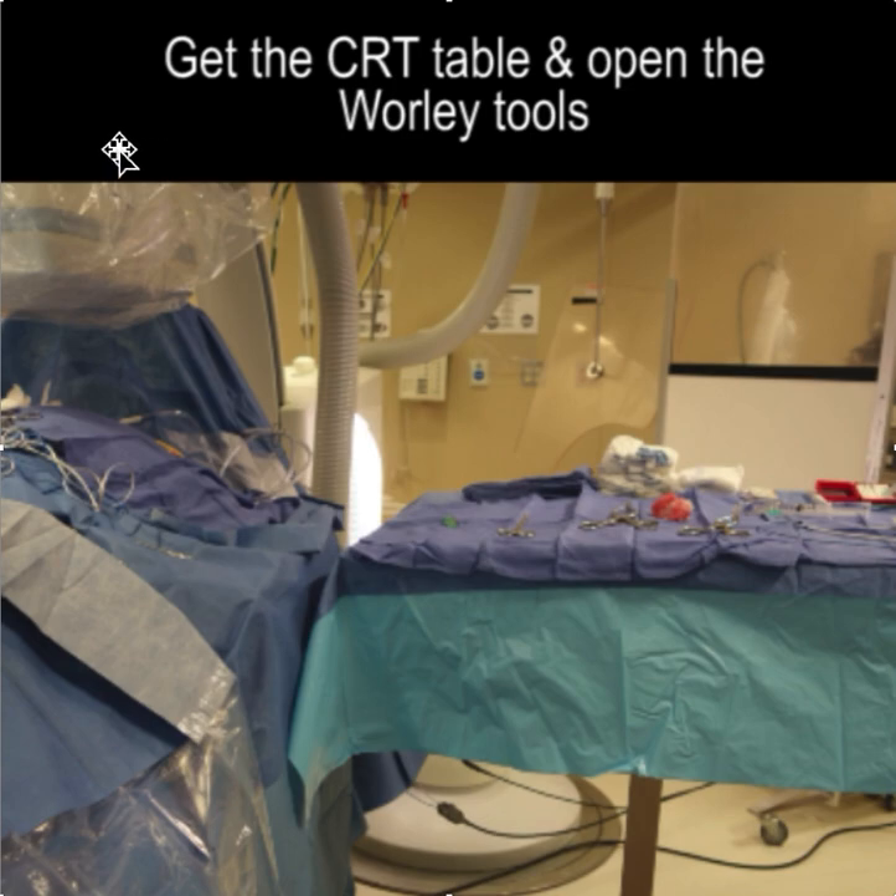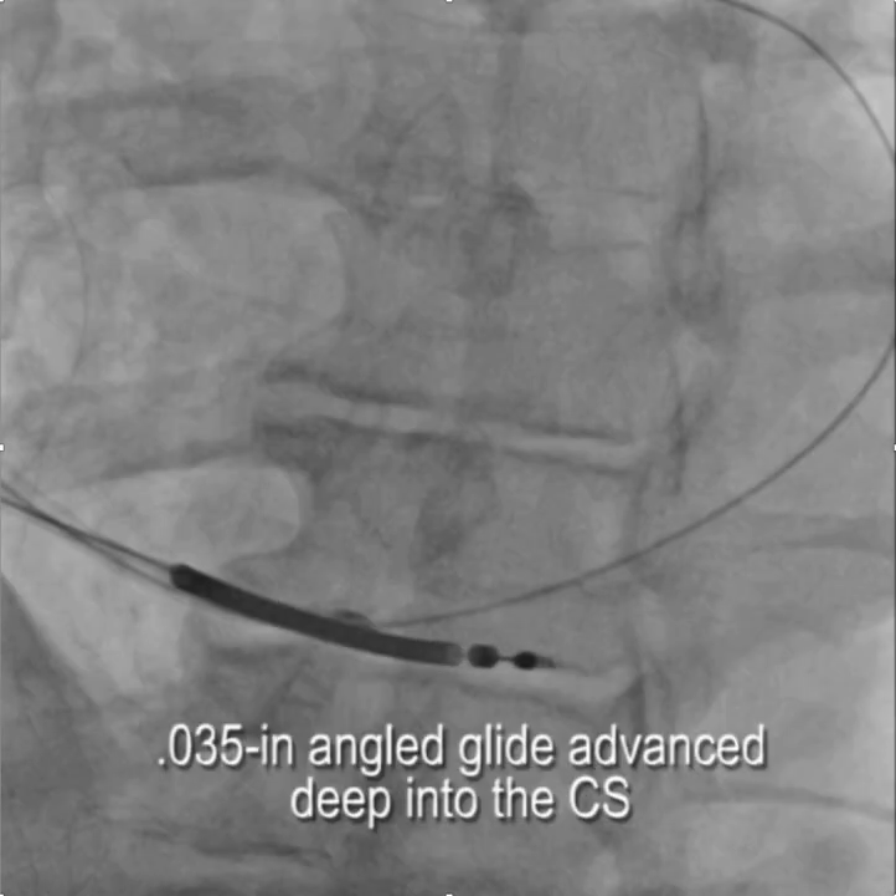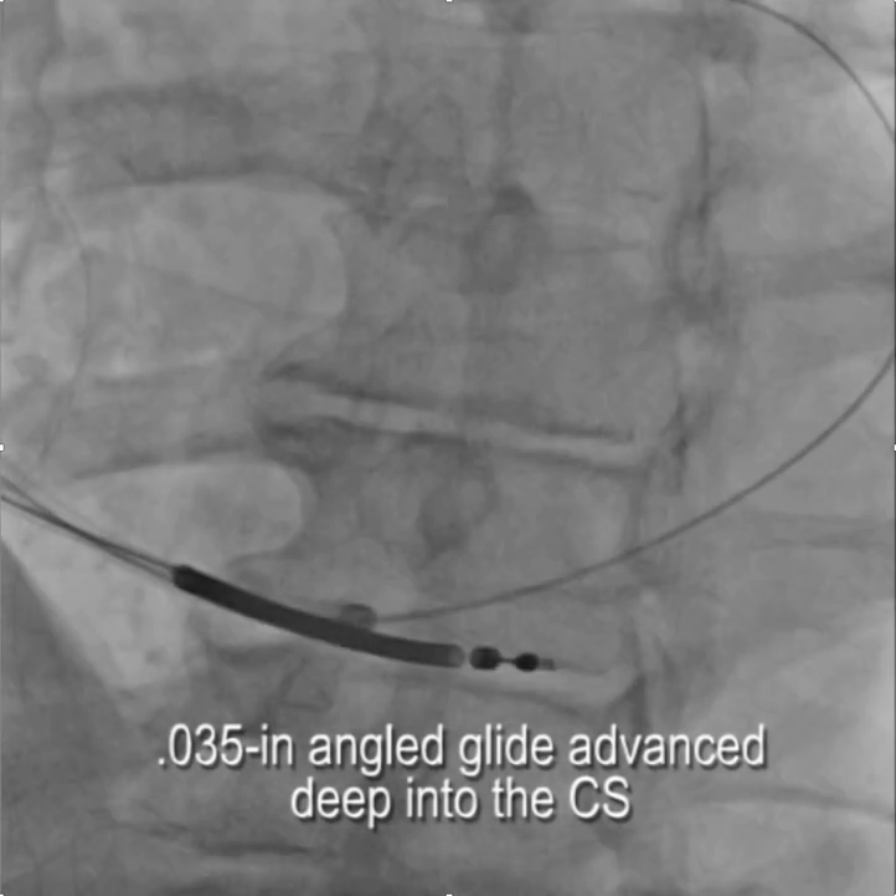We got out the height-adjustable table with an extension and the Worley tools, and here's how things went. The first step was we were able to engage the coronary sinus with a standard braided core and then advance an 035 angled glide wire deep into the coronary sinus.